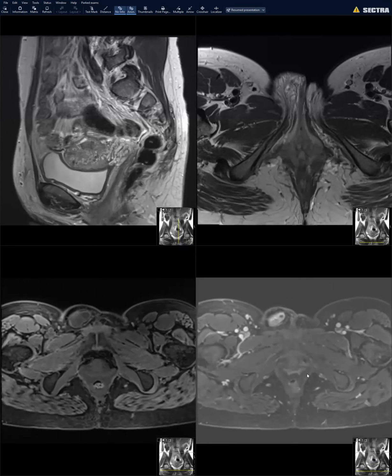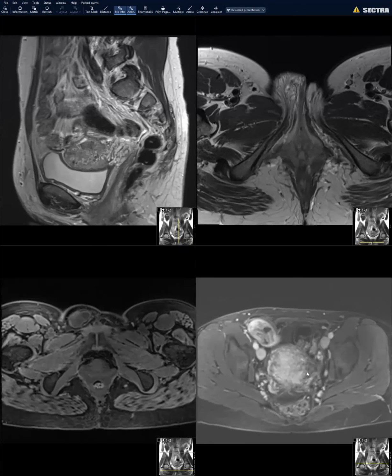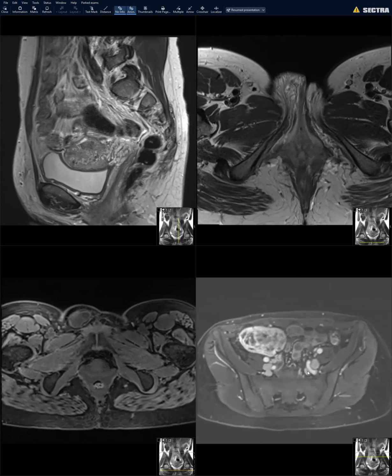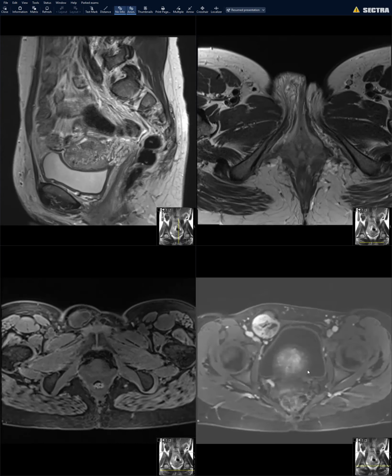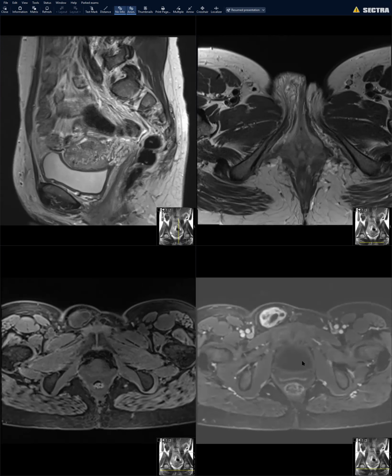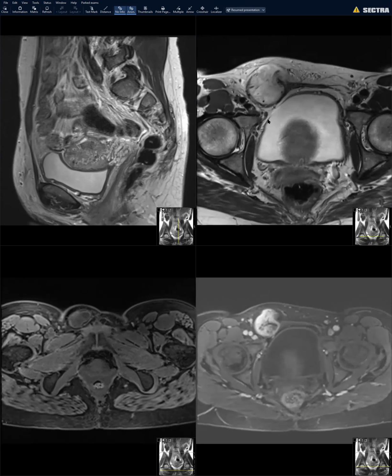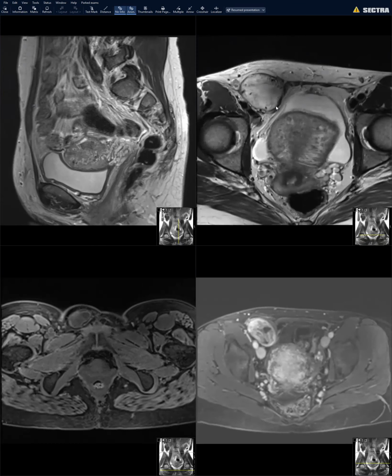So, some sort of hernia, okay, but not just. Trying to figure out what's going down the inguinal canal here. Yeah, it's like an enhancing mass. It was pretty T2 bright. Right. So it was going down like where... It's a myxoid sarcoma. Good thought, myxoid, because it's bright on T2.